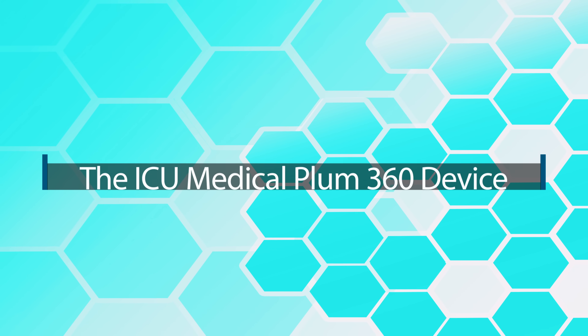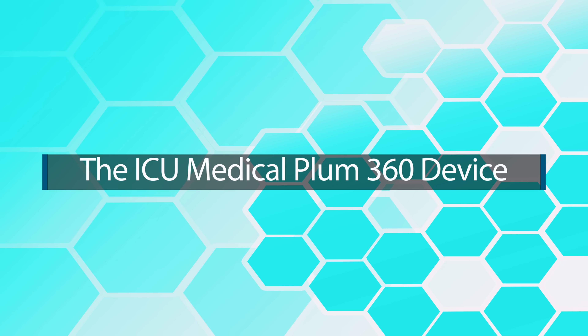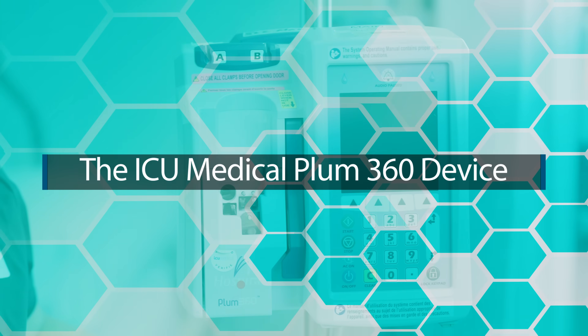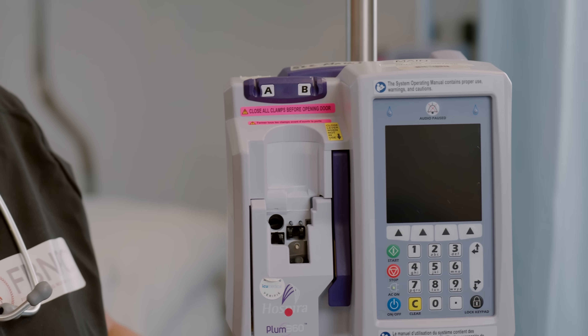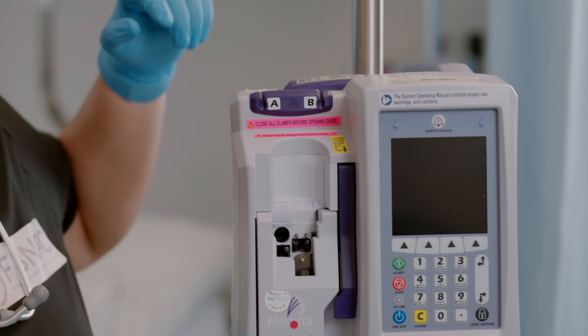Let's learn about the smart pump. We'll be demonstrating the Plum 360 device. It's a smart pump, meaning you can have your hospital's customized medication formulary uploaded into the device via the MedNet safety software. This software prevents medication and IV programming errors.